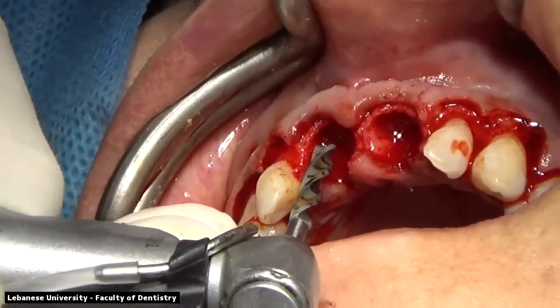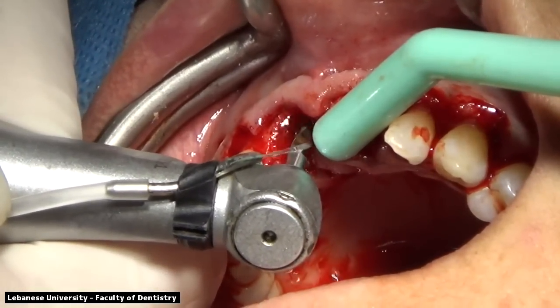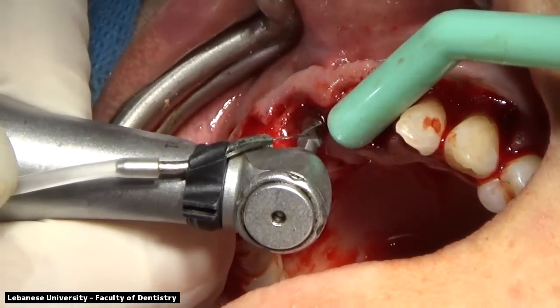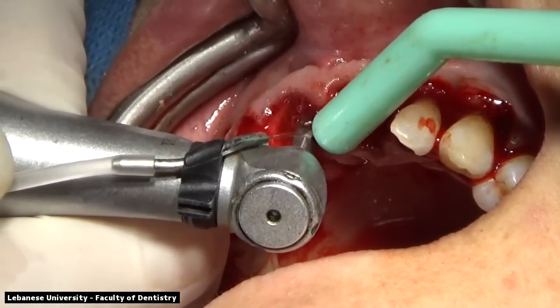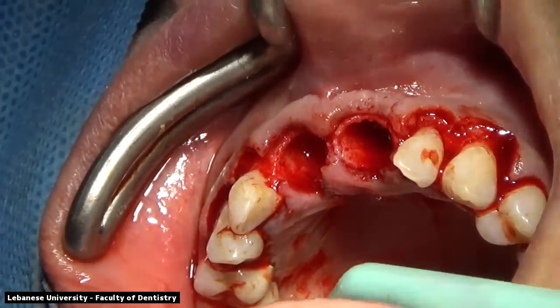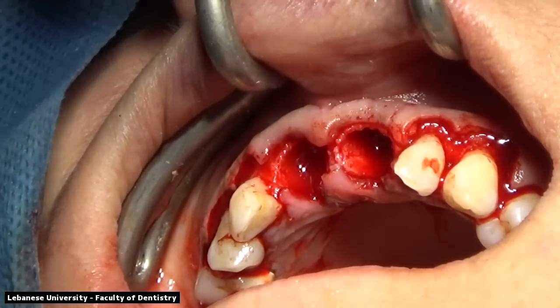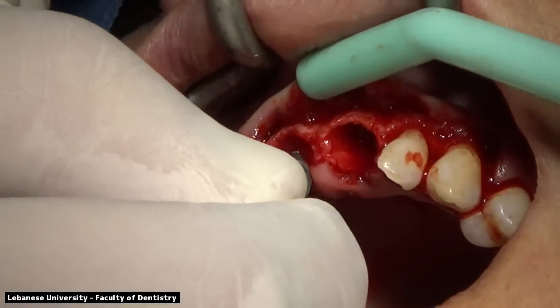So the shoulder of the implant will be at the buccal level. So when we're looking for our reference, we're looking at the buccal crestal bone, and the markings on our implant drill, which is the 2 millimeter twist drill, will be to the 13 millimeters when referenced by the buccal plate of bone. Because the buccal bone, again, as we said previously, is about 2 millimeters away from the cementoenamel junction of the neighboring teeth.